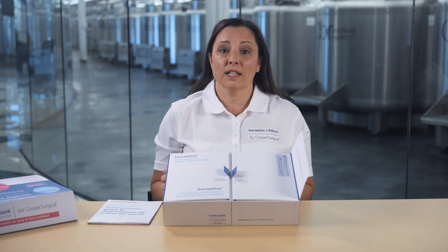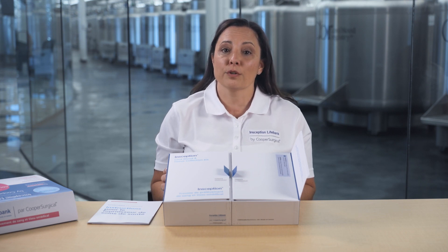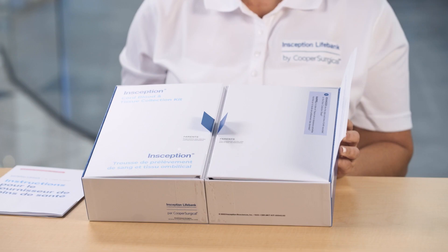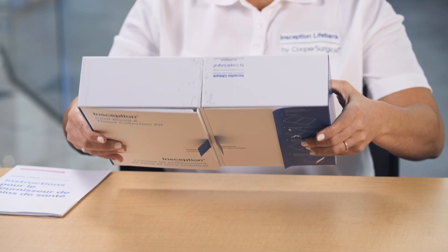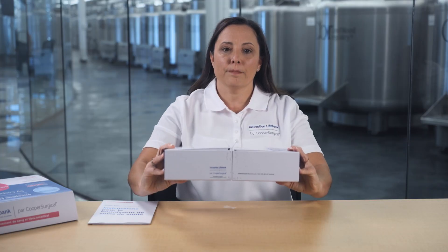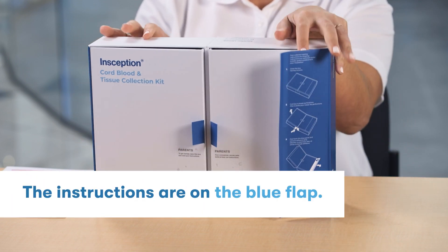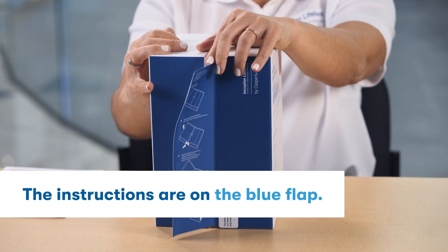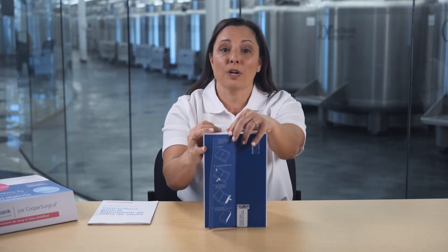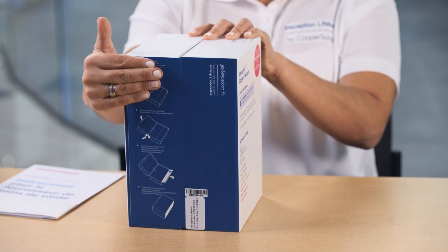If the birthing facility cannot complete the maternal blood collection, please follow the alternative option explained on the maternal serology requisition. As you can see, there are seals on the top of the box and on the bottom. Please break both these seals and close the kit into a cube. The blue flap here is going to allow you to seal the kit properly — pull the blue flap up and smooth it over like this.